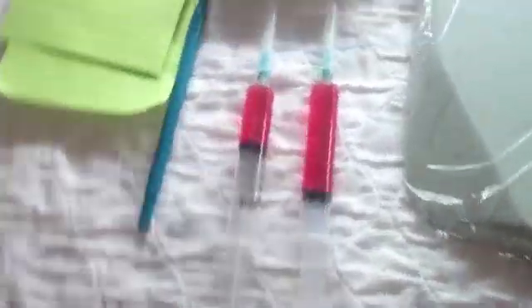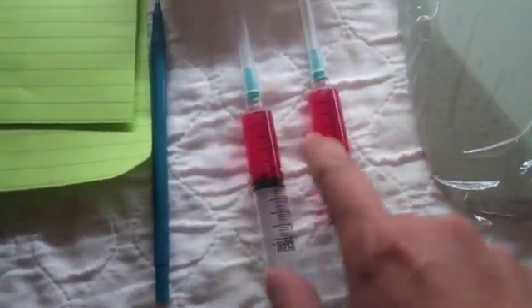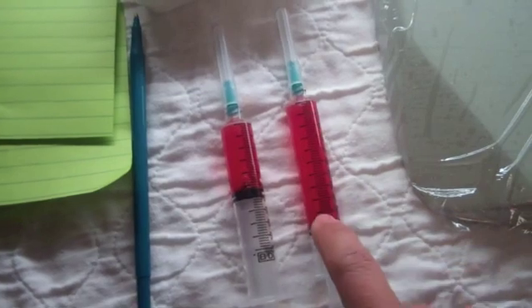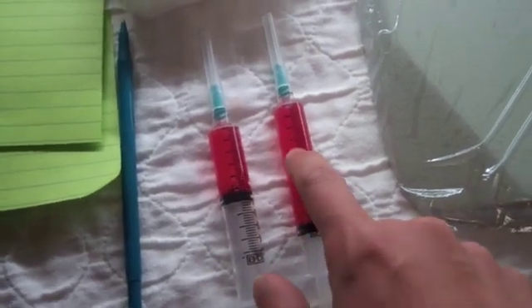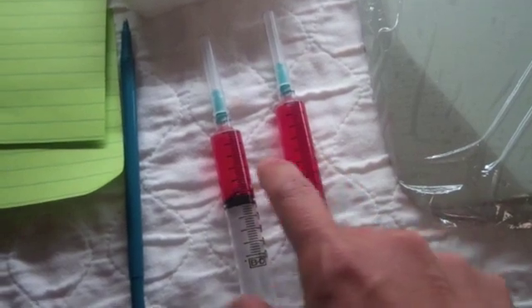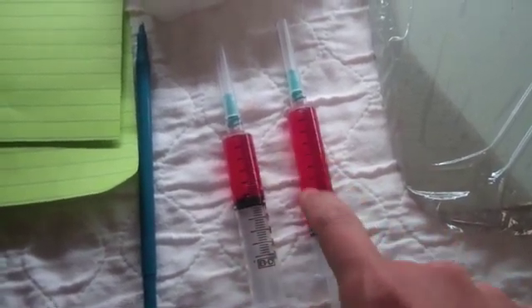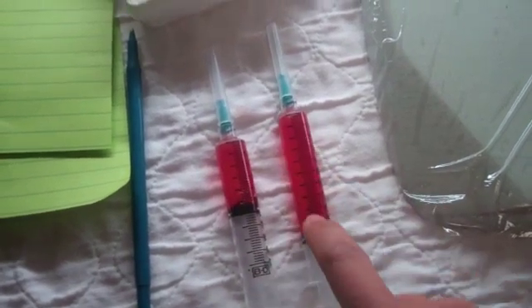Walking over here, this is just plain PRP, and this is going to help donor healing. This is the area where we've harvested, and with robotic technology, even without this it still looks amazing. But this is just an added level of benefit for the donor healing, to expedite healing in a very fast way.